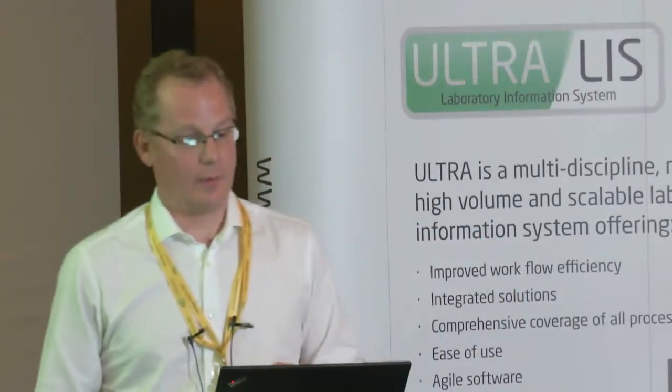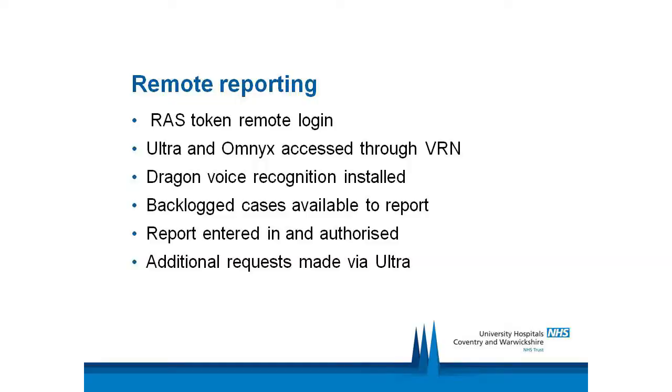We've covered a little bit about workflow management and how that can improve your efficient use of pathologist time. And we'll talk a bit more in a minute about the quality advantages. But one thing which we hadn't foreseen, which I think will make a difference to digital pathology and will be important for the future, is remote reporting. So we had thought it might be useful for home working, and we had thought about how that might work, and we've now realised that actually this is becoming a very, very important part of the whole project.